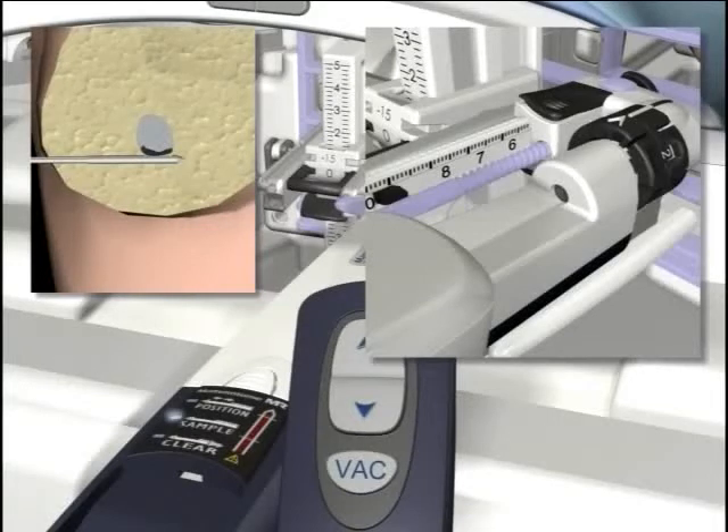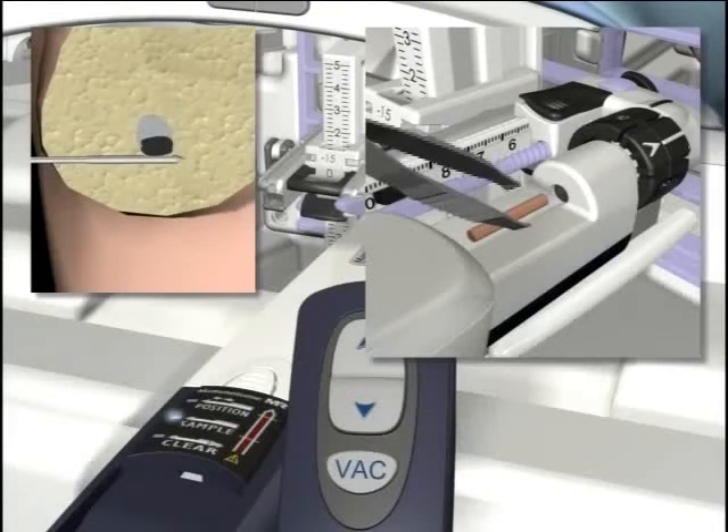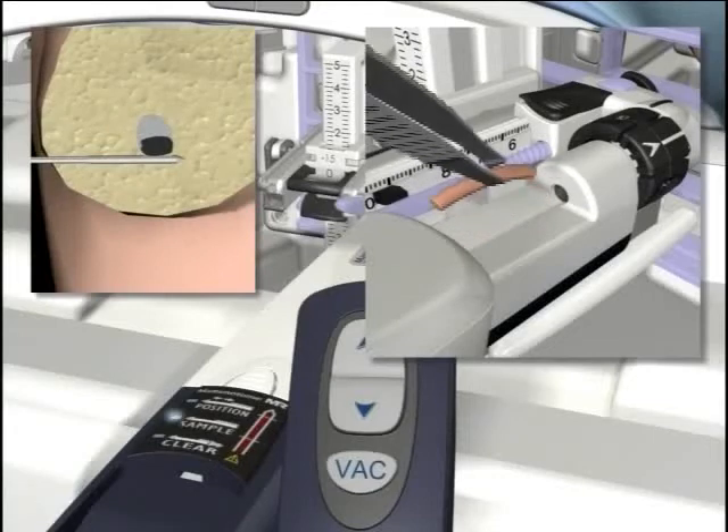Before taking another sample, rotate the thumb wheel in the direction desired to take additional samples during the biopsy process. You can also use the remote thumb wheel to rotate the aperture.